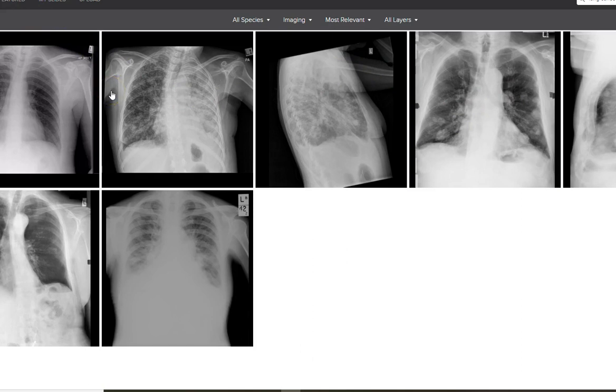I hope that's been a useful summary of how I think about and use chest X-rays. My greatest advice probably would be to get your eye in, look at every chest X-ray you can. The more normals you see, the more likely you are to pick up something that's abnormal. Do chat to the MDT about it. Don't be frightened to ask a doctor what they see. Often they're really pleased to have a chat.